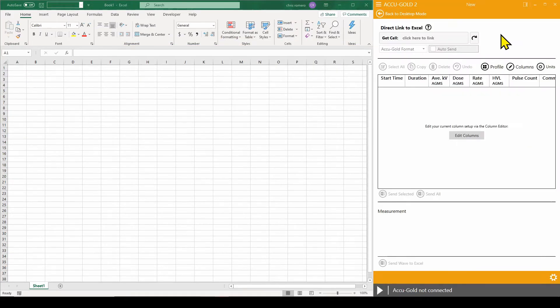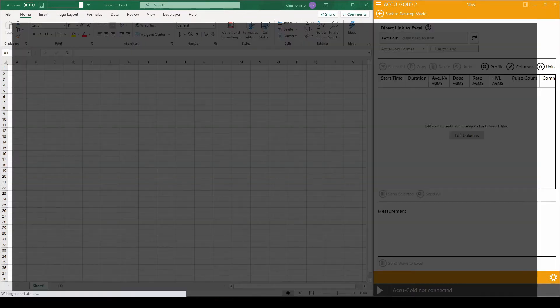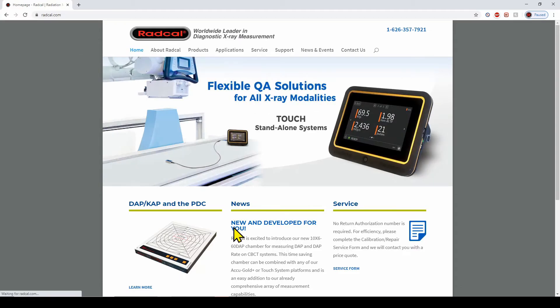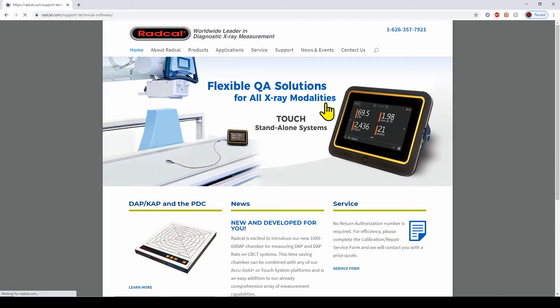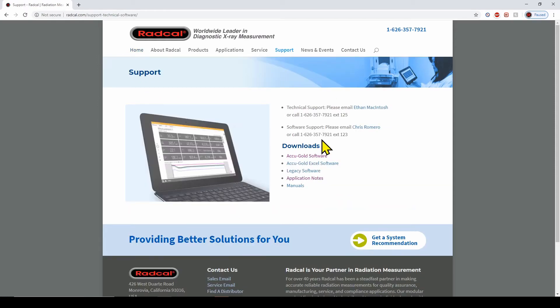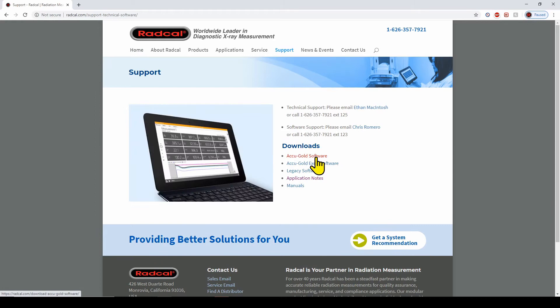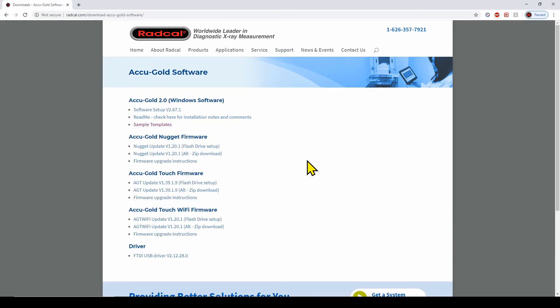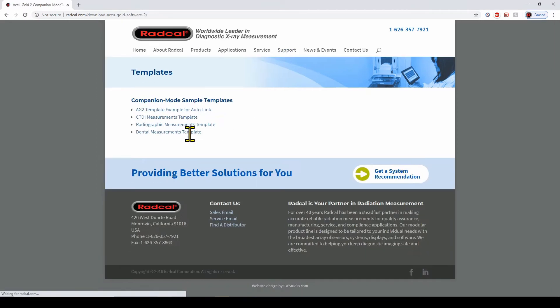We will start by copying the output headers to the data sheet. To do this, we need to download the example template from the RADCAL site under Support AccuGOLD Software. Click on Sample Templates and download AG2 template example for AutoLink.